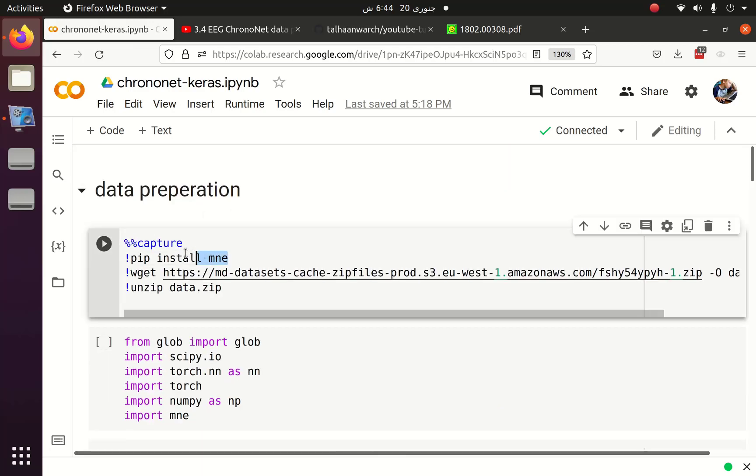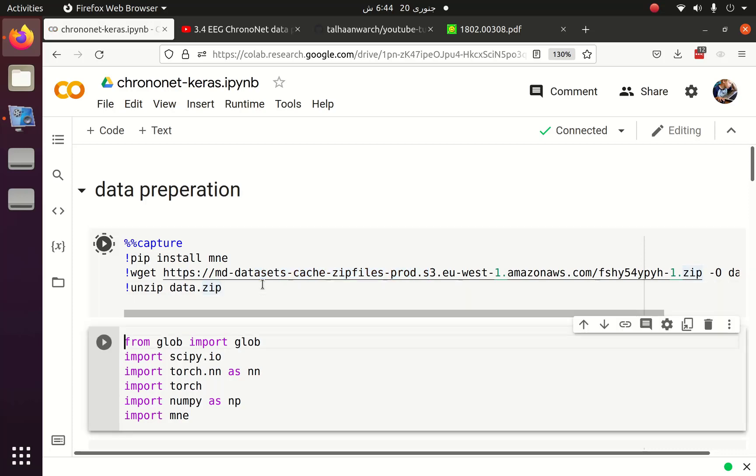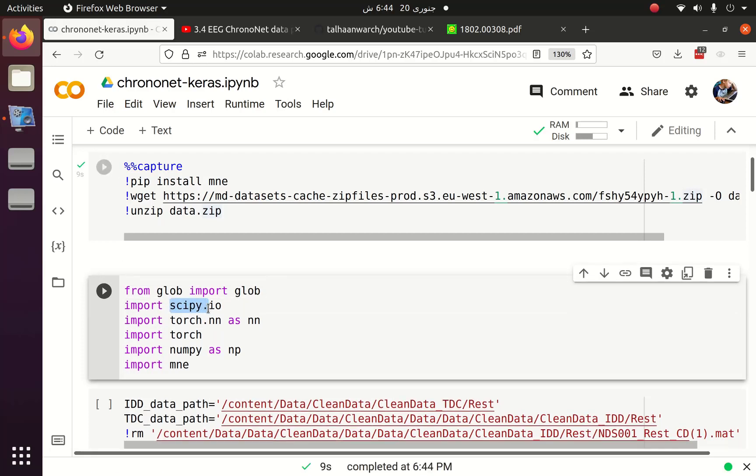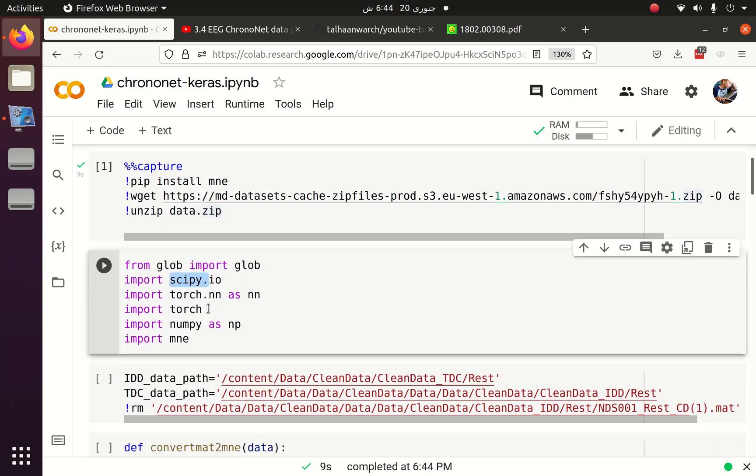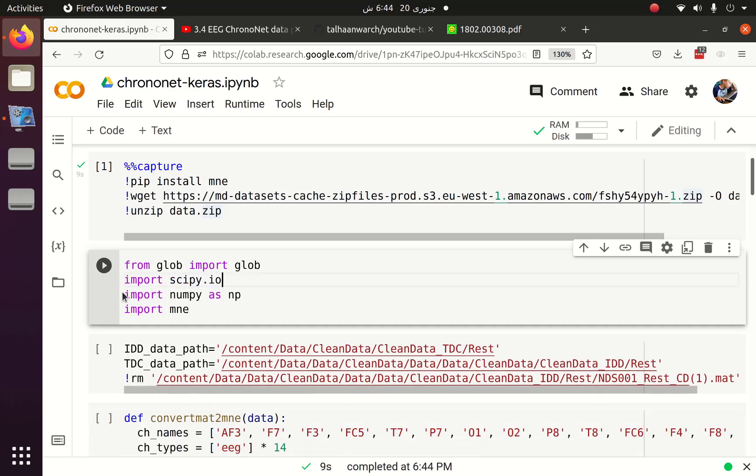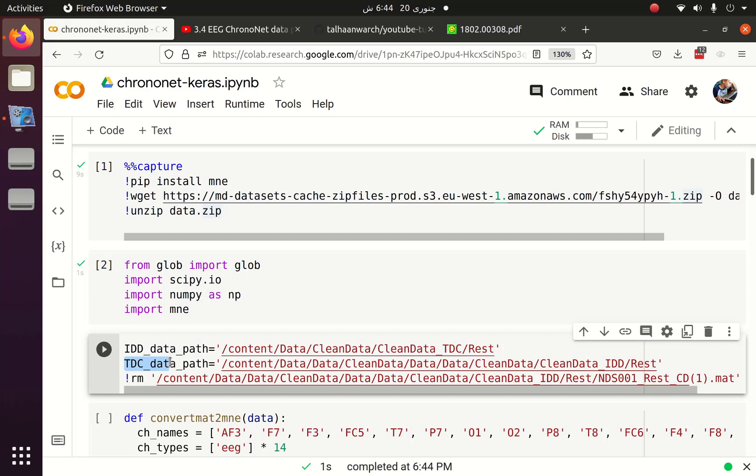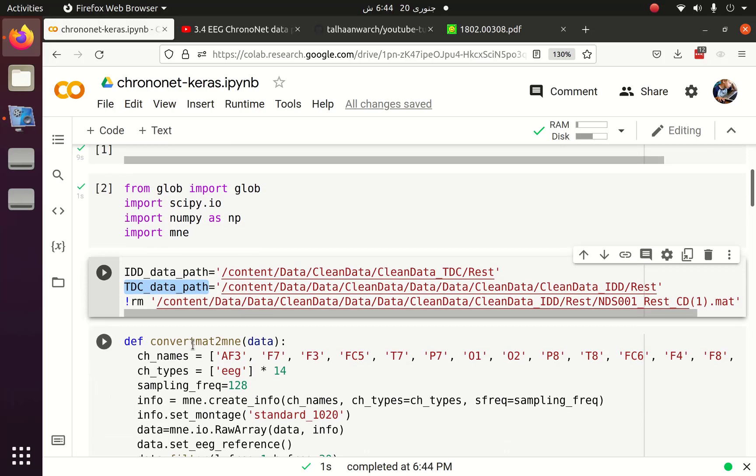Now let's start with the revision of the data preparation part. First we install MNE, then we download the data and after that unzip the data. There are few libraries which I am going to use such as scipy. This is used to load the data because currently the data is in .mat format. These are the paths of dataset for control and IDD patients.